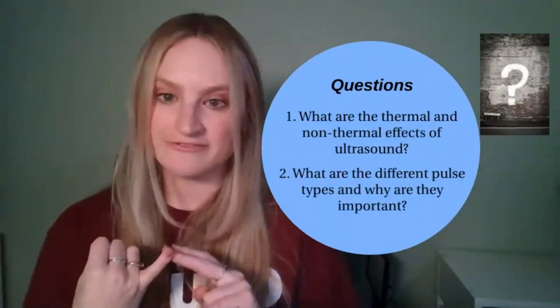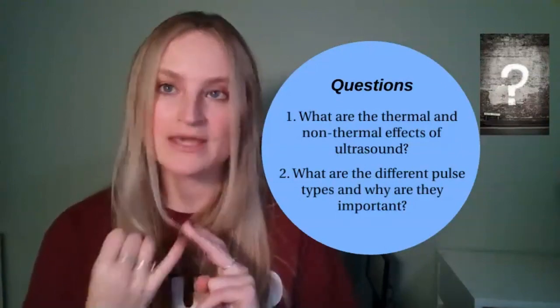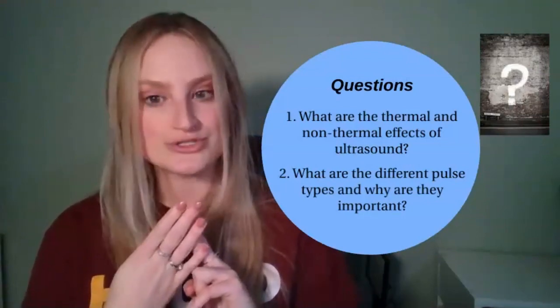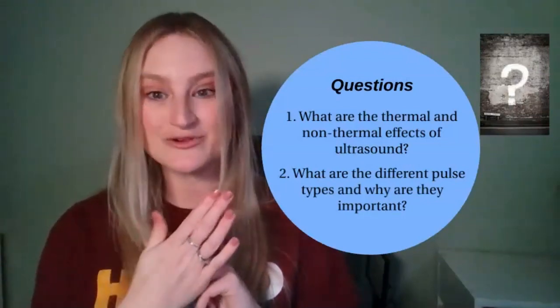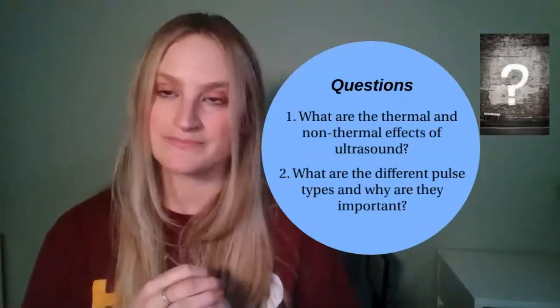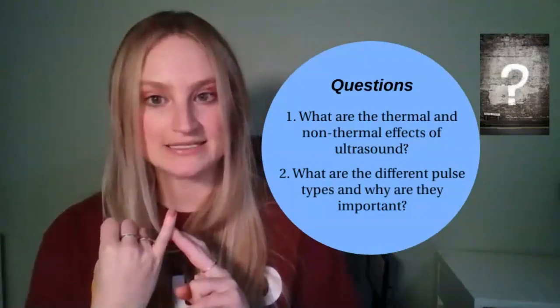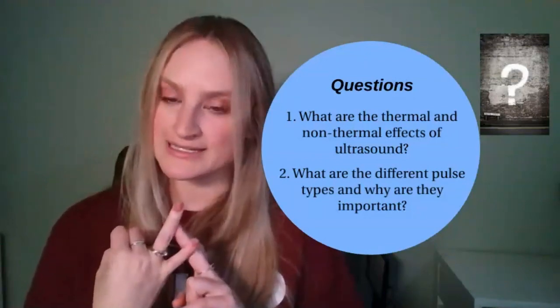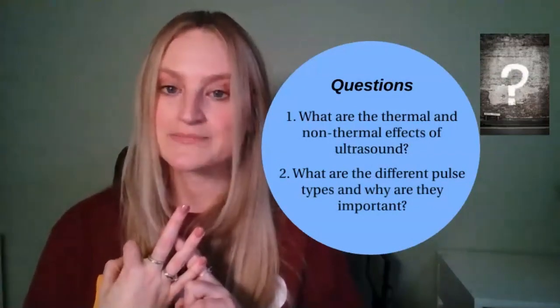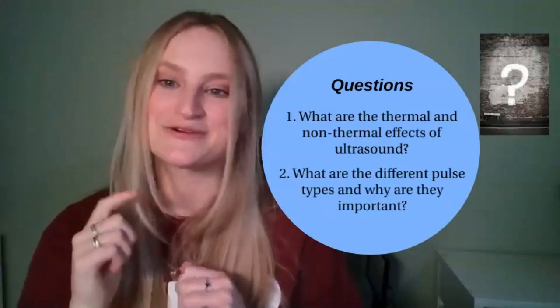Well, thermal effects include increased collagen extensibility, increased blood flow, less pain, reduced muscle spasms, decreased joint stiffness, and less chronic inflammation. The non-thermal effects include increased fibroblastic activity, increased protein synthesis, encouraged tissue regeneration, swelling reduction, bone healing, and decreased pain.